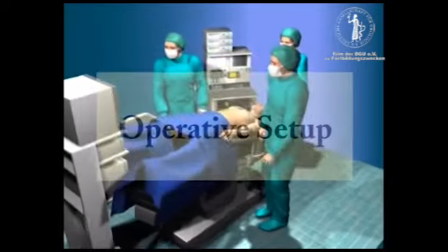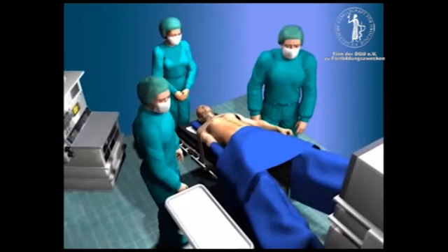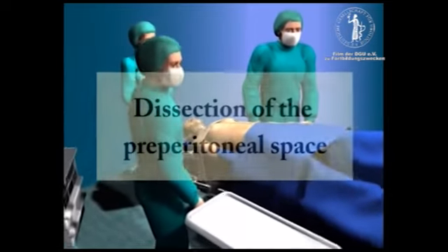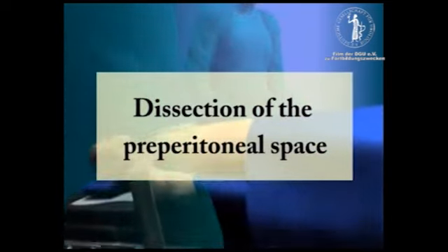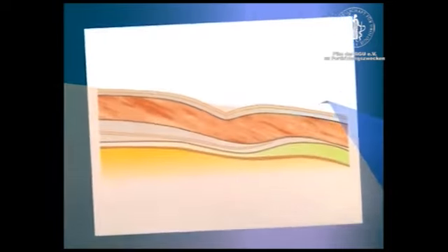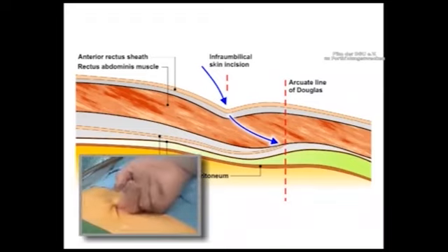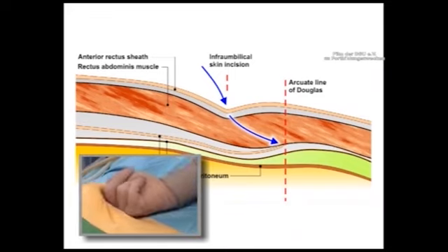Endoscopic extraperitoneal radical prostatectomy, a strictly extraperitoneal procedure, is usually performed with the patient under general anesthesia. The initial step of the procedure is the creation of the extraperitoneal space. A 1.5 cm right infraumbilical skin incision is made, followed by an incision of the anterior rectus fascia.